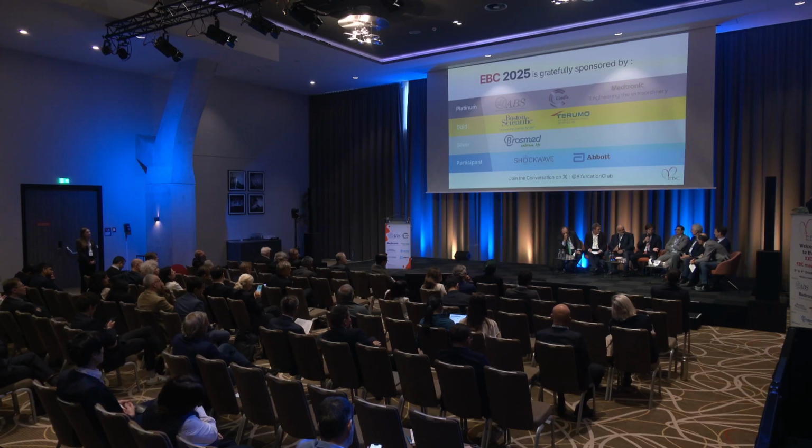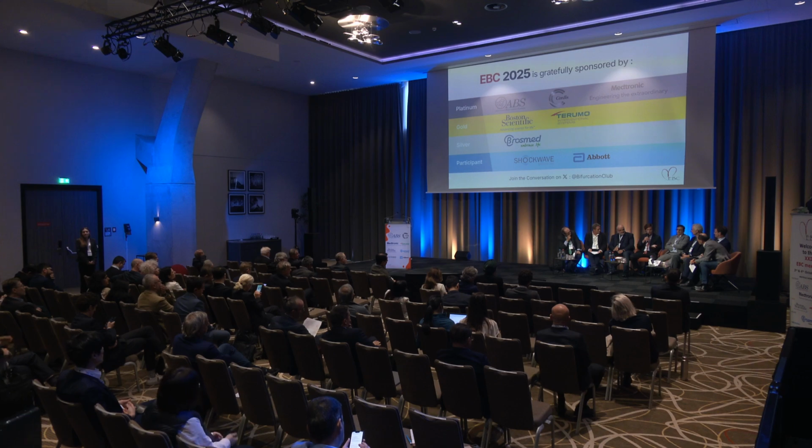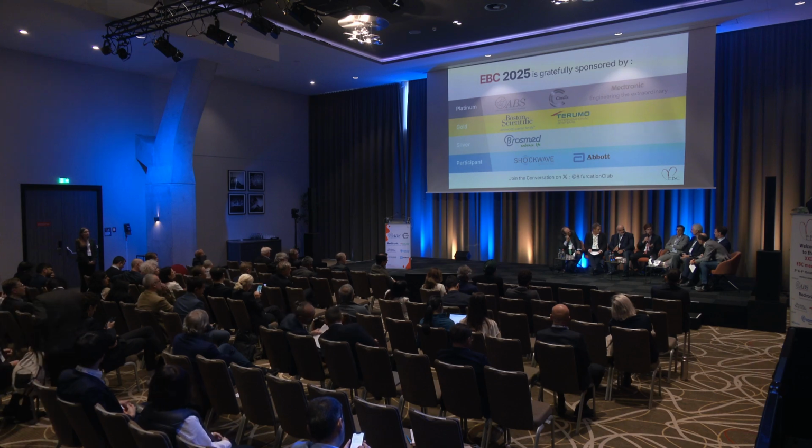Yeah, and I think also that imaging is key. But the problem is also that in DCB we have no data on imaging use, so we can use imaging to understand, and to reclassify the Medina, because of course if you do imaging in the main vessel, in the LAD, maybe you understand that it is not only a 0.1 Medina, but maybe there is also disease in the ostial LAD. And so you have to treat also the ostial LAD, but of course we have to know also what to see with imaging after DCB treatment.